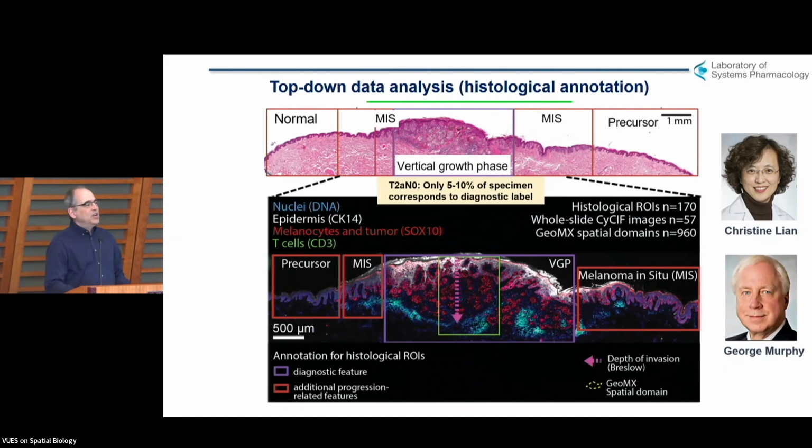So this field has not been, and to this day at Harvard hospitals, most of this data is not digital. Everywhere else in the world it is digital, but it's been fairly slow to become digitized. You could imagine, and in fact this is the case, pixel level learning on these types of images could be very valuable, and you've seen a lot of these foundation models come out over the last few years. What's interesting is how poor the labeling is in these foundation models.